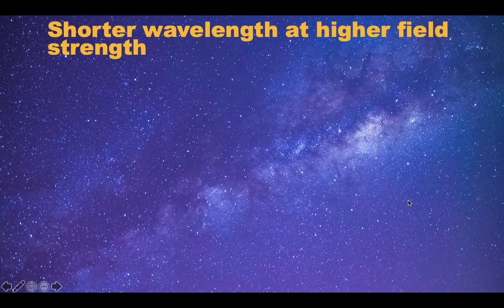With the advantages of ultra-high field, naturally we want to increase our field strength, but we cannot just directly jump to ultra-high field. Aside from the engineering challenges, one side effect of ultra-high field is the shorter wavelength of the RF.